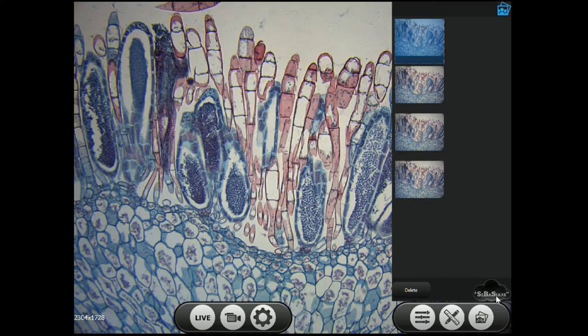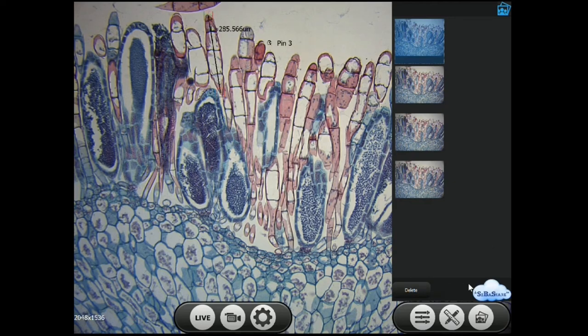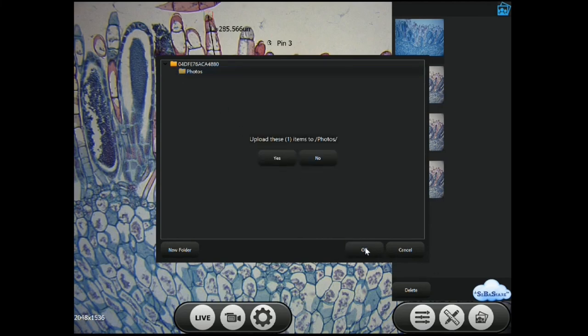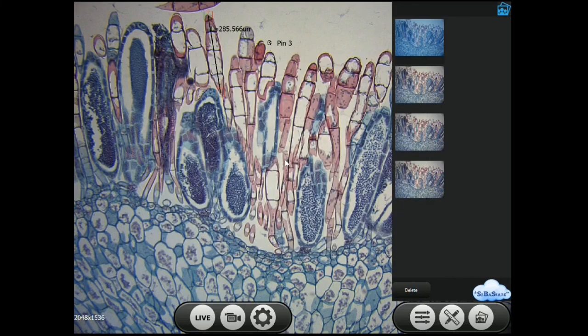To log into your SibaShare account, add your SibaShare card to the Siba logo on the front of the microscope right under the eyepieces. Once logged into your SibaShare account, click the SibaShare icon, choose a folder to save it to, and hit OK. Please see our other videos on the SibaShare software for more information. To return to taking live images, click the button that says live.